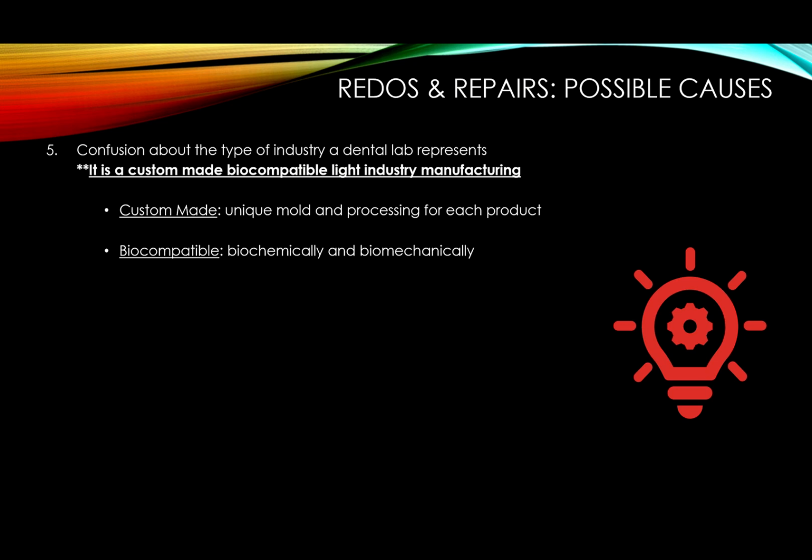I just looked around and came up with this: it's a custom-made biocompatible light industry manufacturing. Anything that's custom-made has a unique mold and processing for each product. It's not like a mold of a cup, where you pour 1,000 cups out of that mold, or a mold of a ring, where you manufacture 1,000 rings from that mold. No, it's custom made.